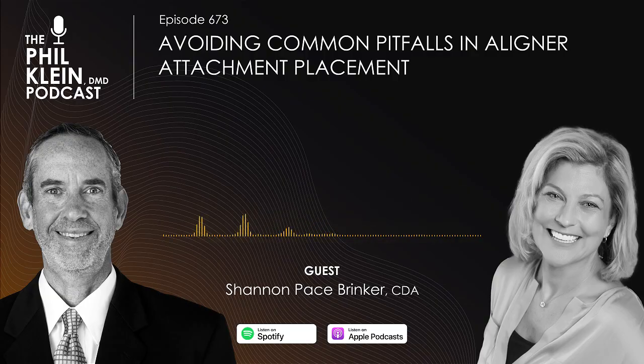It's great. Let's say you've finished the attachment placement, you've cured everything, you've removed the template. Then, of course, I would assume you try in the aligner to make sure it fits right where those attachments are and it seats 100%, and then you're good. Absolutely.